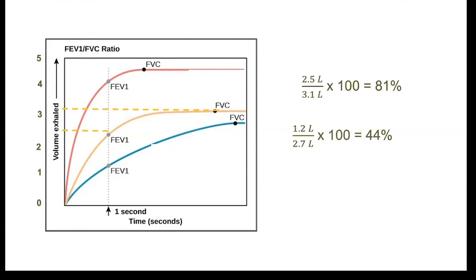However, look at the FVC. On the test, I will be using examples from a young adult male, and the FVC for a young adult male is 4.8 liters. Therefore, this FVC is low. If the FVC is low, but the percentage is within the normal range or higher, you have a restrictive lung disorder. Let's move on to the blue reading.